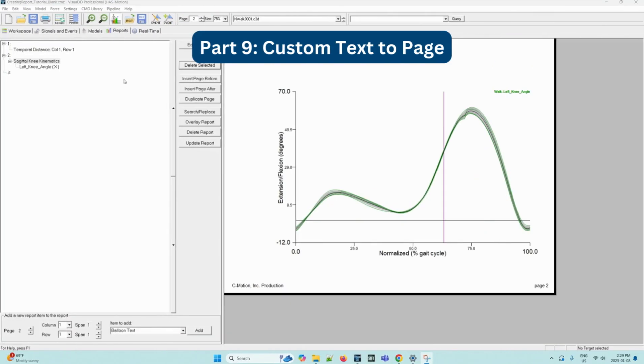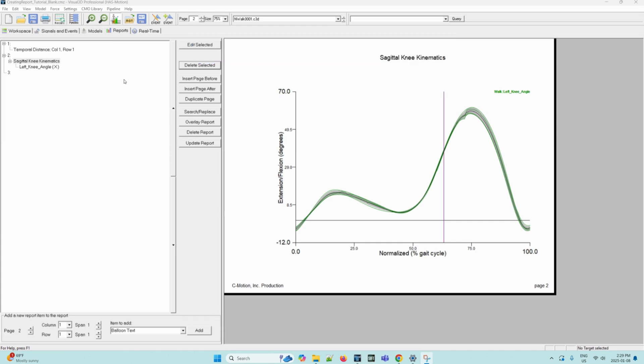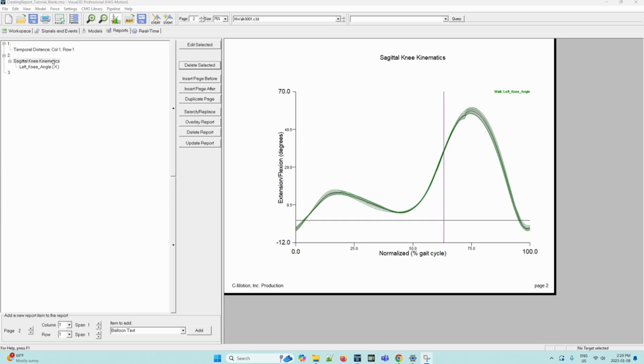Moving on, we can edit the text on a specified page. This option is available on newer versions of the visual 3D application. So make sure your version is updated to the latest release. To add text annotations in earlier versions, the make_text_annotation pipeline command must be used. In this case, we will be doing it on the current page. It should be noted that this edited text is specific to the page and not to the current graph.